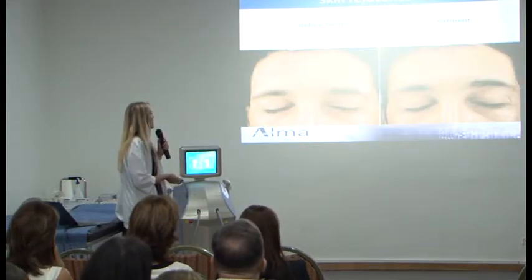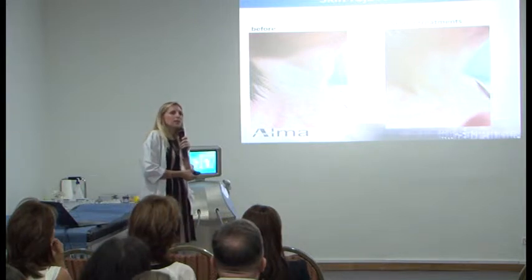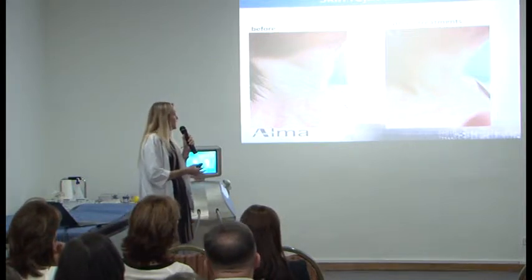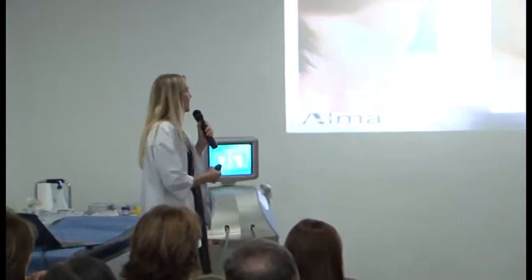The treatment is also good for skin rejuvenation. You can see the improvement of the wrinkles over the forehead. Neck. Neck area, you know the neck is a problematic area. We don't have a lot to offer our patients until recently because we don't want to be too aggressive at that area because the healing process of the skin is not so good. But on the other hand, usually the face looks very good because we treat the face because everyone wants to treat the face. And as we get old, the neck tells our age because you can see the signs of the age on the neck.